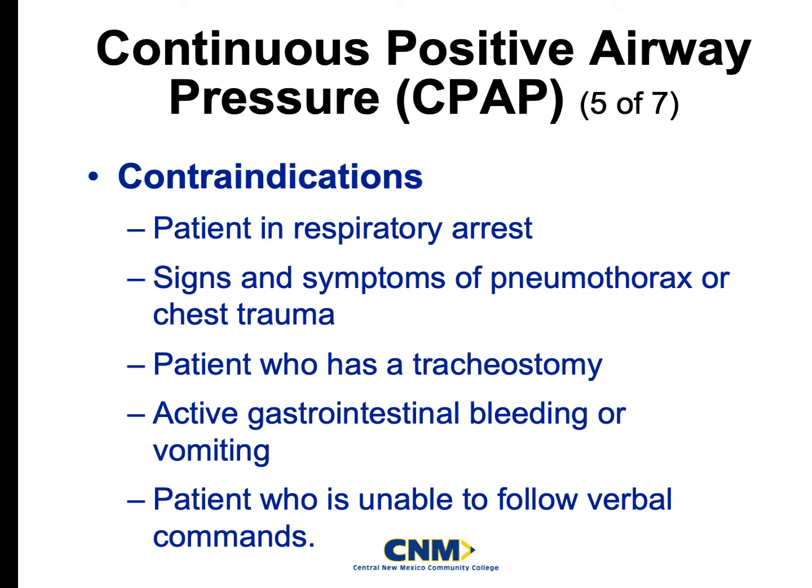Contraindications for CPAP. Your patient is in respiratory arrest. They do not have their own respiratory drive. Okay, you can't do that with this machine. This is a point where we need to whip out the BVM and start breathing for our patients.